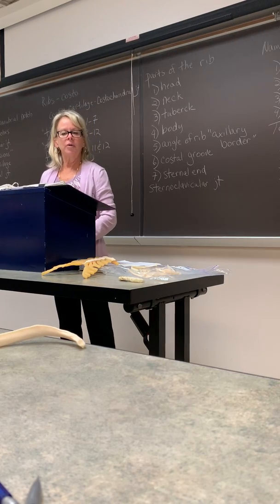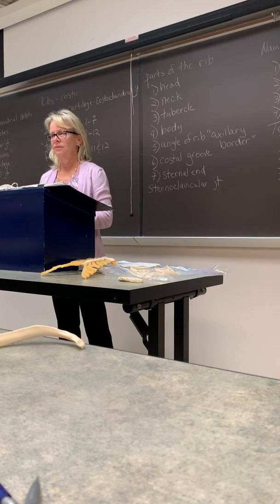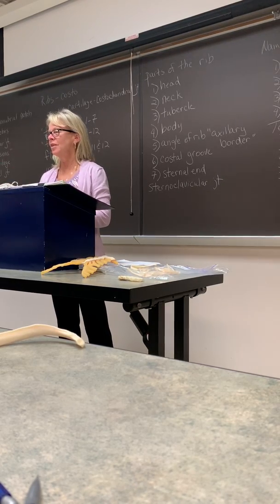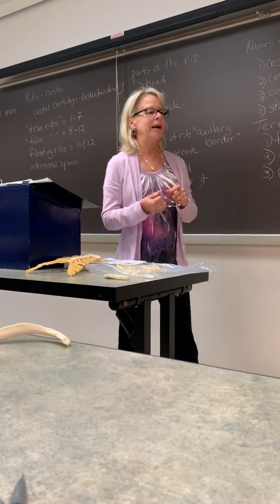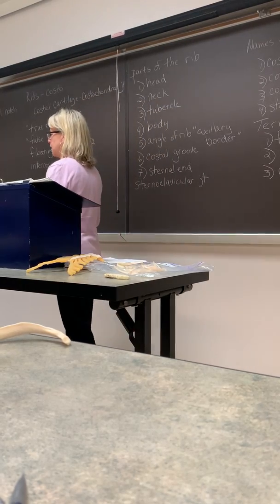Okay, sternum and trauma, what do you think the most important image would be? Cross-table lateral, that's your answer for anything if they ask you the most important, whatever, and trauma, doesn't matter what you're imaging, it's always the cross-table lateral.